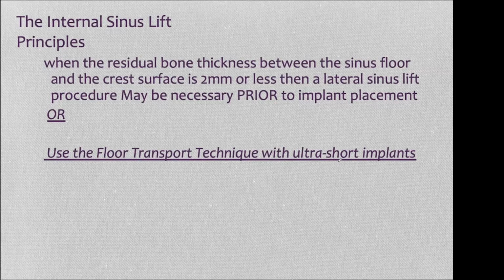Now, one of the other limitations of the internal lift or the vertical lift is how much can you really push that membrane blindly, vertically through a hole in the center of it and expect it to kind of follow you and not tear. As a rule of thumb, I've noticed when the osteotomy is small, intuitively, the amount of pressure I can exert on it and not cause it to perforate is a lot smaller. And therefore, I can make it travel only about a distance roughly equal to the diameter of that osteotomy. And therefore, whenever I wanted to do an aggressive sinus lift without a lateral lift, I would go to as wide an implant as possible, but that taps out at about 6. So I can lift it 6 millimeters.